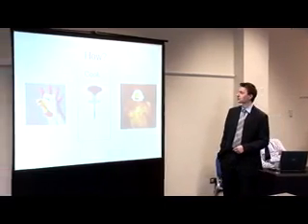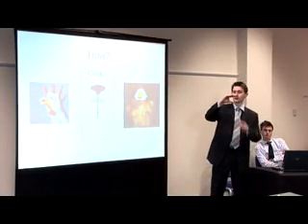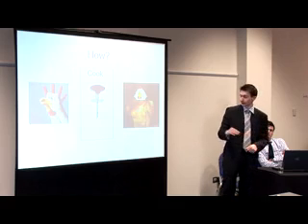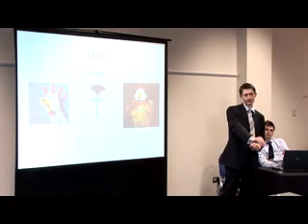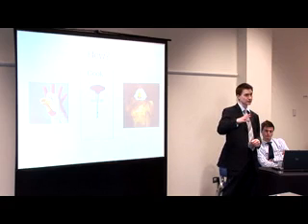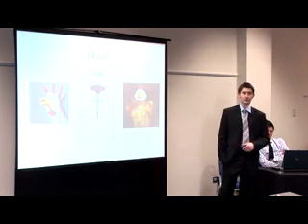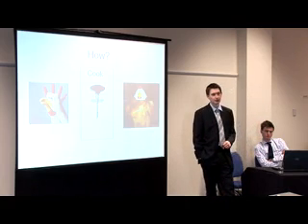Okay. So you hold it in your hand like that, okay? You take the black part in the palm of your hand, you get the same landmark, and then you use a constant pressure, rotating motion back and forward. You go through the cortex, and then you feel a give, and that's you in the medullary canal, and it should just stand up straight at that point. It can take a little second to get through it, but they're the cheapest ones, and they're the ones that have been around for a while, so you may see that in a few of the resus bays that you have.